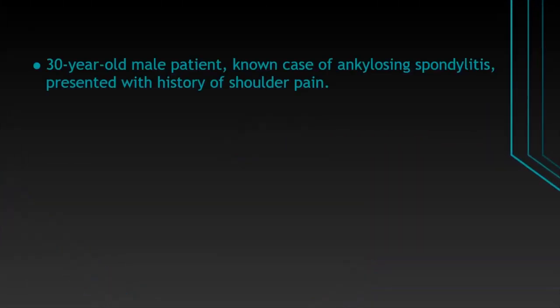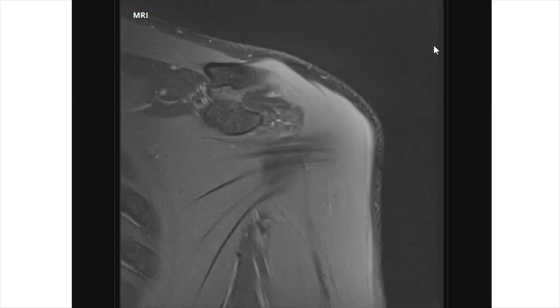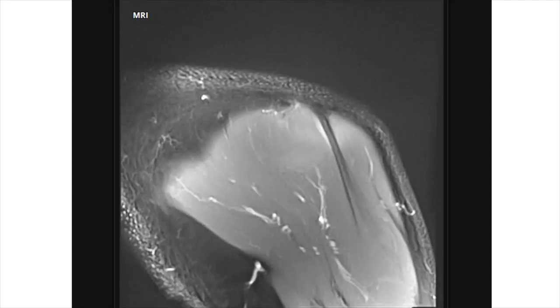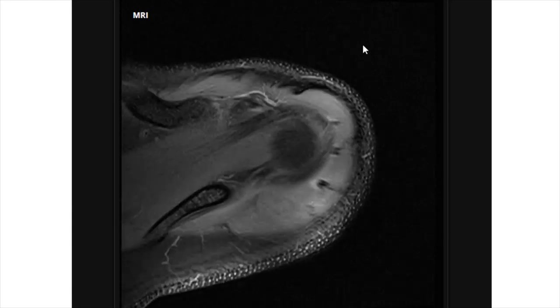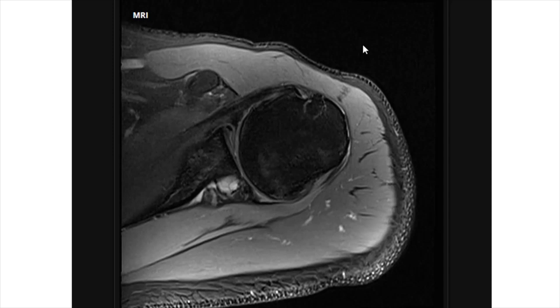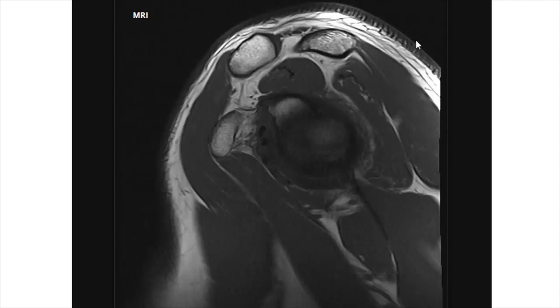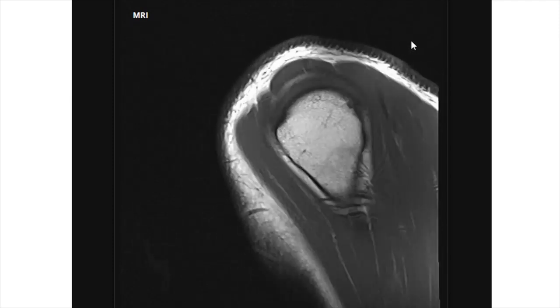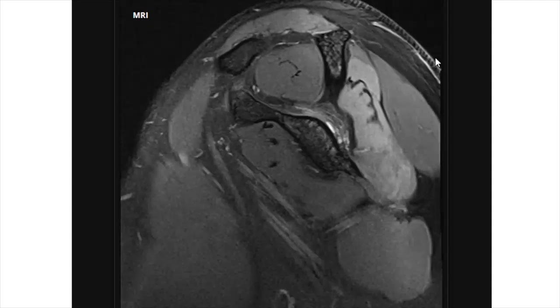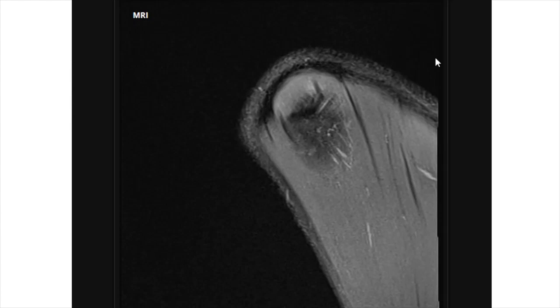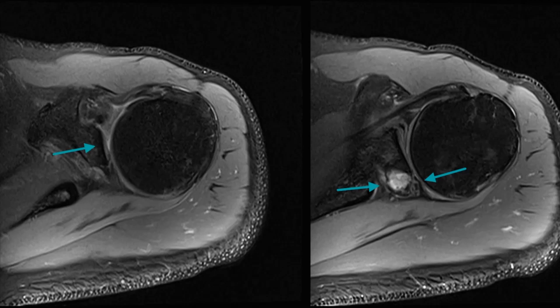Coming to the last case: a 30-year-old male patient, a known case of ankylosing spondylitis, presented with history of shoulder pain, and an MRI of the shoulder joint was performed. Axial PD fat sat images show a shallow appearing glenoid which does not closely follow the humeral head, with a posterior labral tear indicated by the arrow.